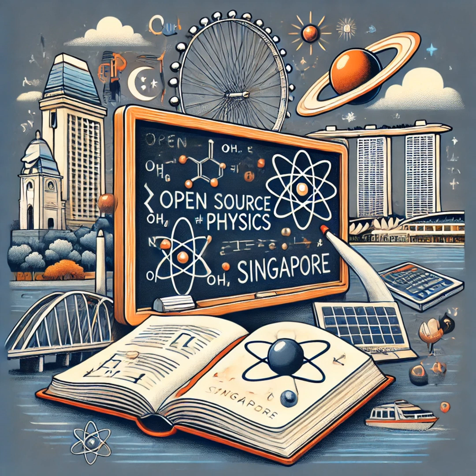All right, so let's dive into this X-ray imaging thing. It's pretty amazing, isn't it? Like getting to see right through stuff. We usually think of it as just taking a picture, but there's way more to it than that. Oh yeah, a lot more. You sent over this really cool simulation called X-ray imaging physics. It lets us play around with how these X-ray pictures are actually made. This deep dive is going to be all about understanding what makes a good X-ray image.